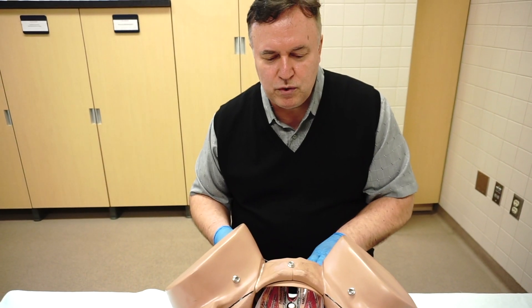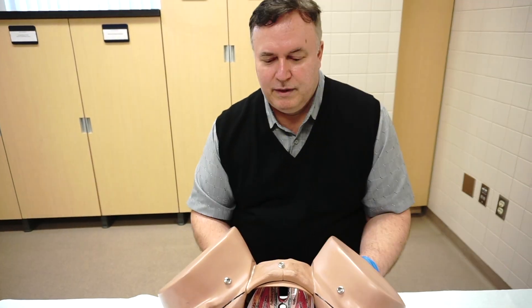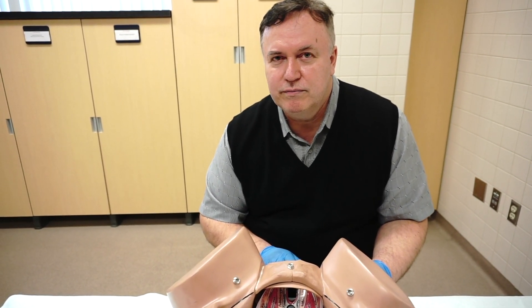Once we have injected solution on the patient's right side, the same procedure is repeated on the contralateral side. At the end of the procedure, I suggest placing a 4x8 sponge with gentle pressure in the vagina to prevent formation of hematoma.